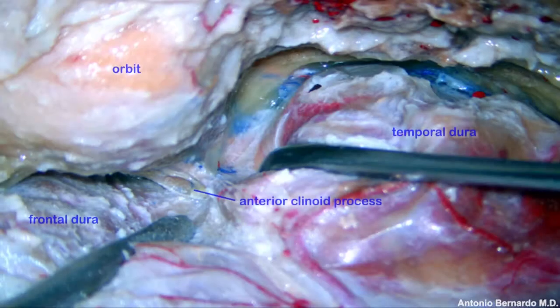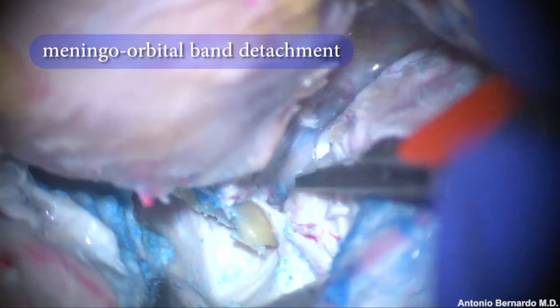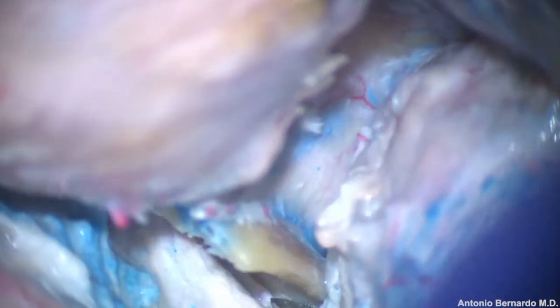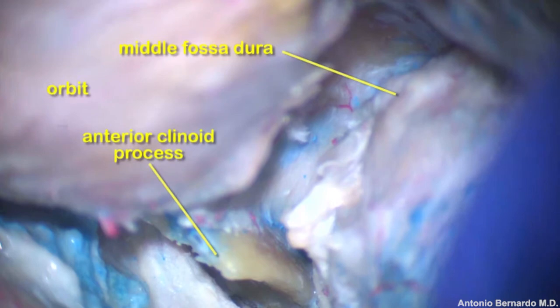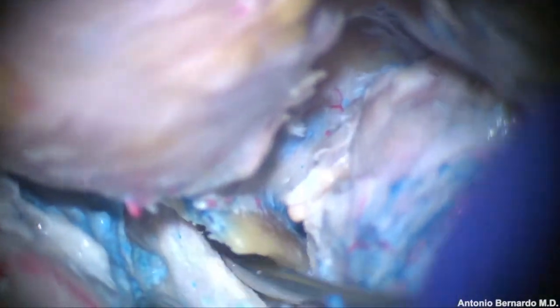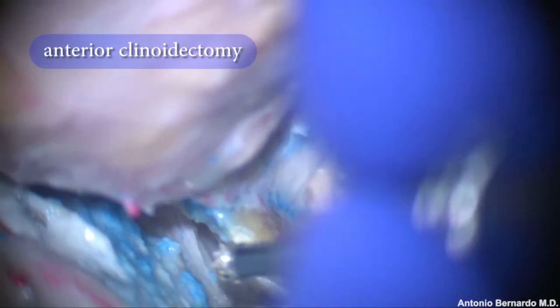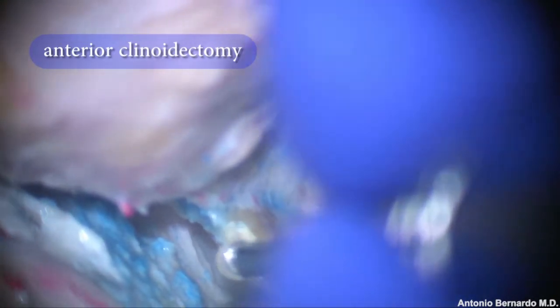The anterior clinoid process is located between the superior orbital fissure laterally and the optic canal medially. The meningeal orbital band is resected until the superior orbital fissure appears. The dura is gently peeled off the superior surface and inferior aspect of the anterior clinoid process. The tip of the anterior clinoid process is completely exposed, and with a cutting burr, the anterior clinoid process is removed.